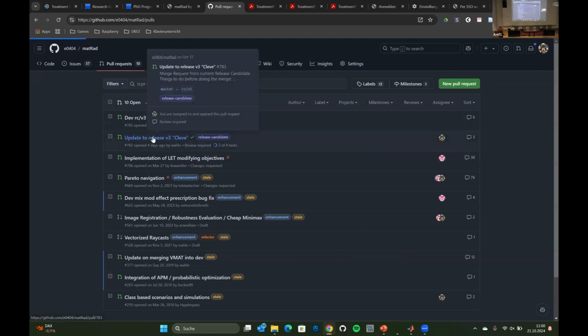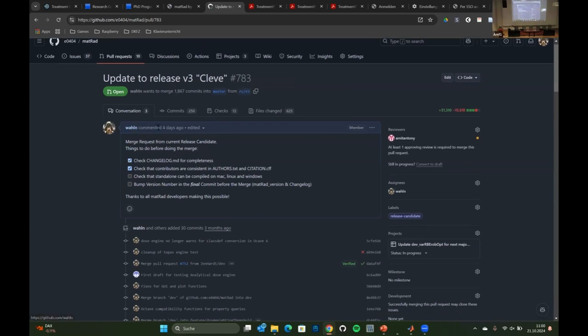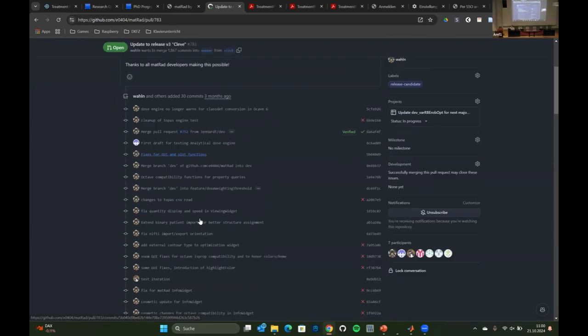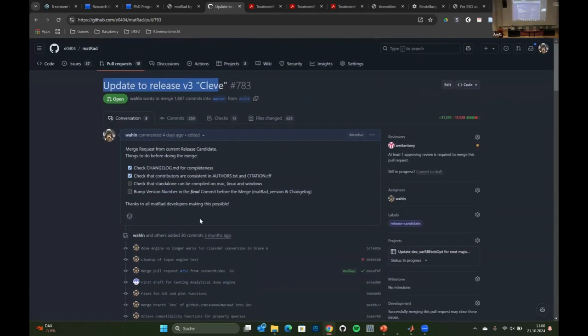And basically here, you see that we are in the final preparations, just 4 days ago. This is basically that we are going for the next release, and this can do all of the new things that I just said. I can show at the end of this day a little bit, maybe go into a helium treatment or do some robust optimization. You won't be able to do it then, but it could be just the last half hour. I give you a little bit of an insight of some of these things. Because especially robust optimization.